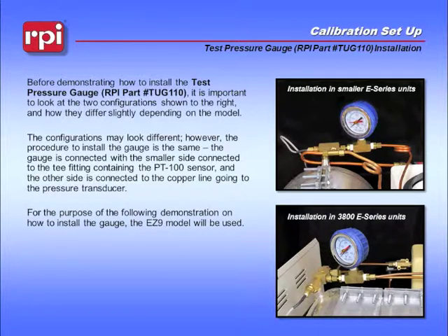Before demonstrating how to install the test pressure gauge, RPI part number TUG110, it is important to look at the two configurations and how they differ slightly depending on the model. The procedure to install the gauge is the same. The gauge is connected with the smaller side connected to the T fitting containing the PT100 sensor, and the other side is connected to the copper line going to the pressure transducer.